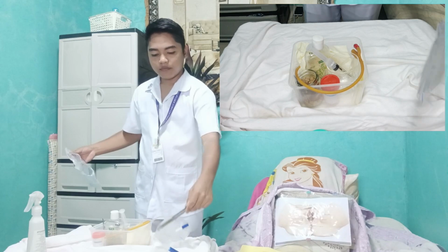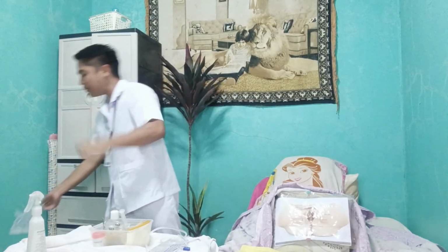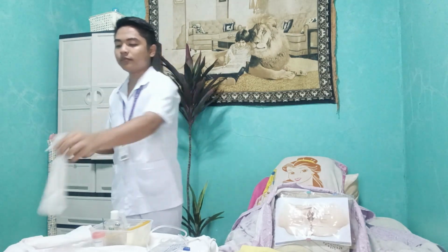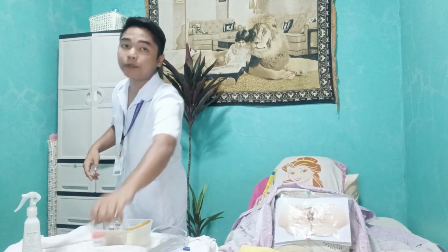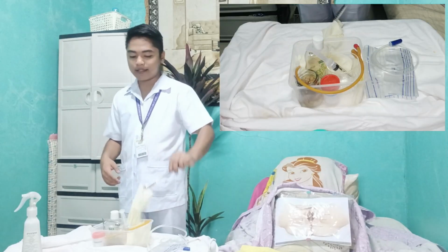And now our catheter, using the forceps, then throw the trash. After doing that, I am going to perform hand hygiene and don my gloves to deter the spread of microorganisms and also to avoid contamination. Now using the forceps, pick up the gloves, and after picking up your gloves, don them.